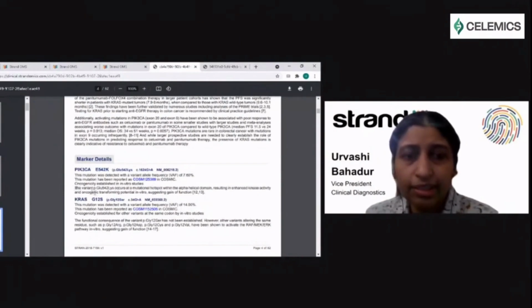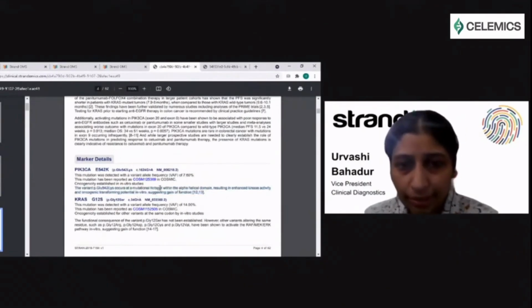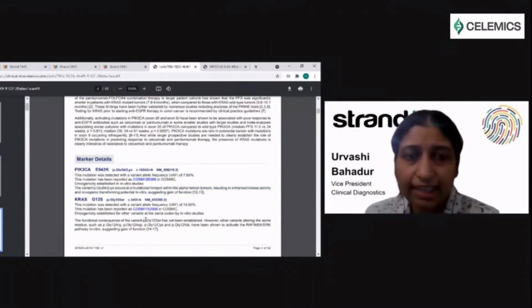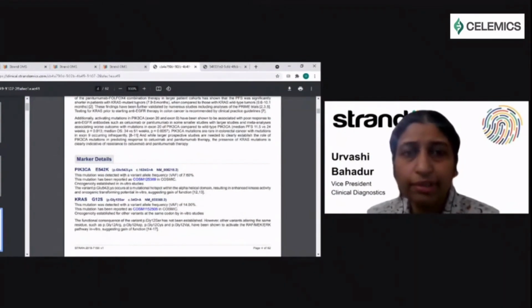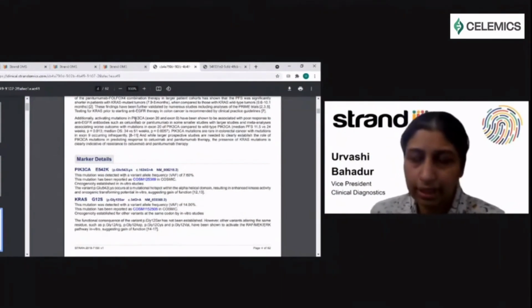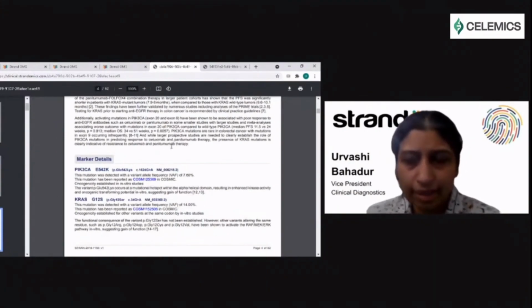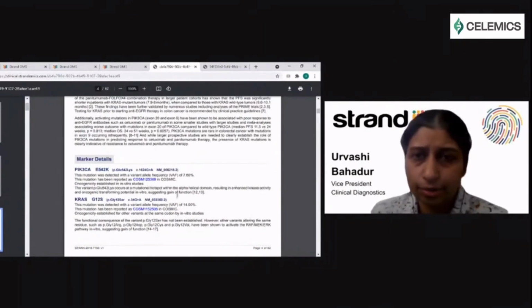Now this is really the description that we have, and we have description for, we've looked at close to 20,000 variants and seen which ones of them actually have a gain of function or a loss of function associated with it. And so that's what we have here. So that's good. It should be noted that here you have two variants for the same drug, and we do have a concept of a combinatorial response also, because in certain cases you have something like, say, T790M and MET or something like that in a lung case. So you can actually have two variants impact the response to one drug.